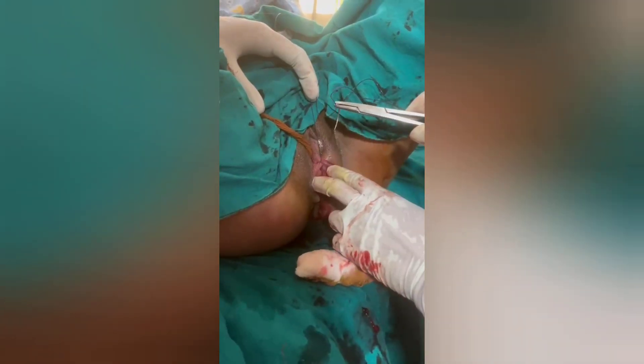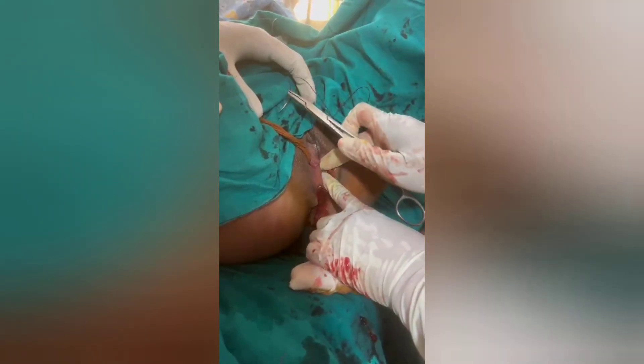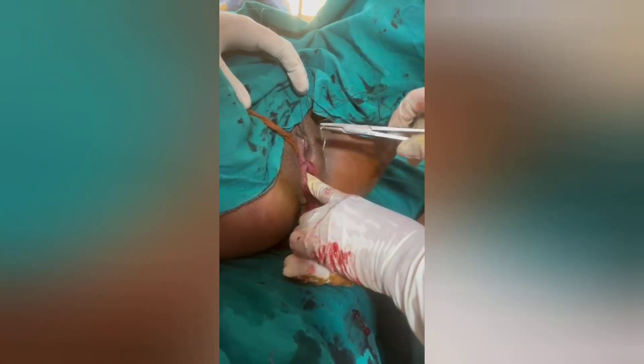The first layer — that is the epithelium. Now we need to assess the depth of the epithelium, because next the deep perineal muscles have to be taken, so assess the depth.